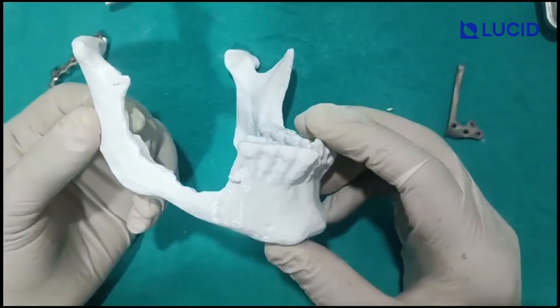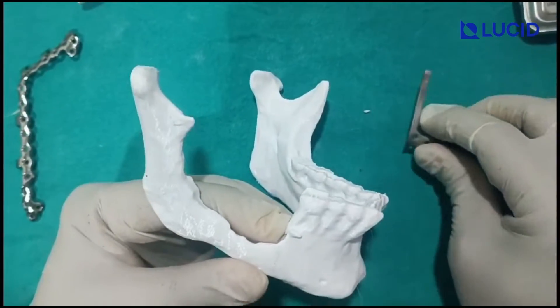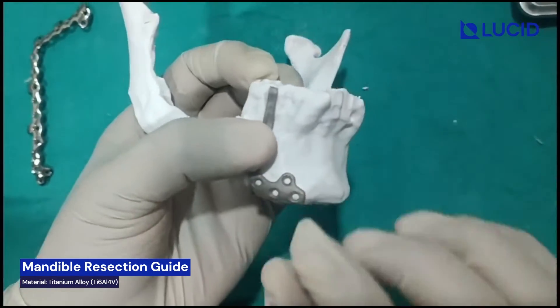This is the case of Shane, a patient for fibular reconstruction. Initially this is the original mandible. Now this has to be resected with this guide. This guide will be placed like this, as you can see.